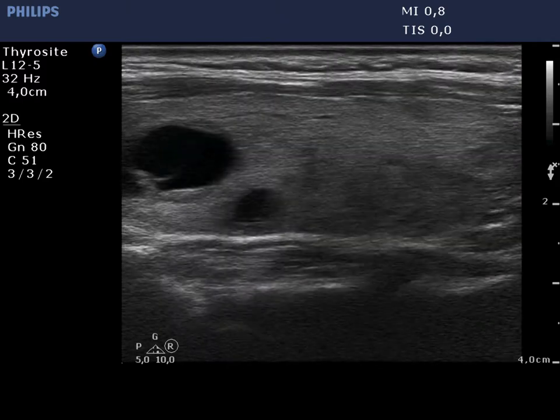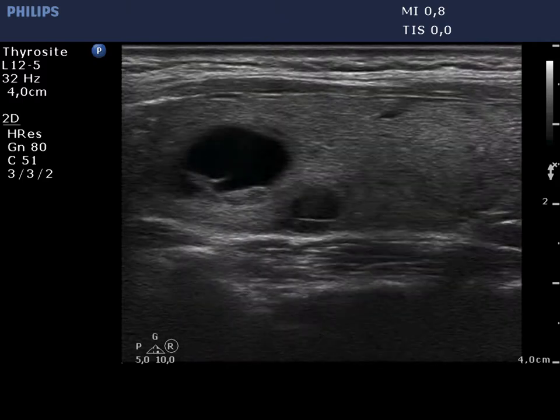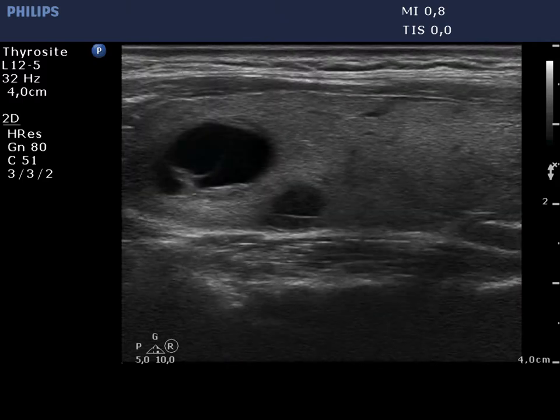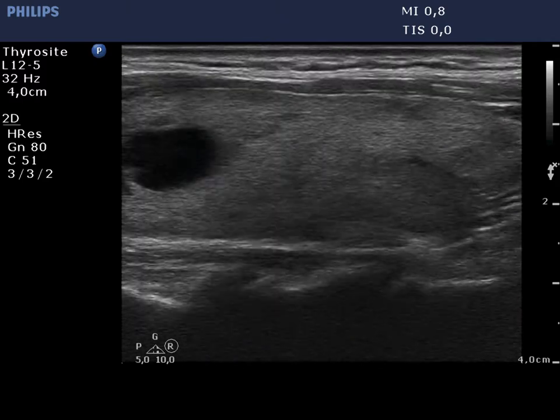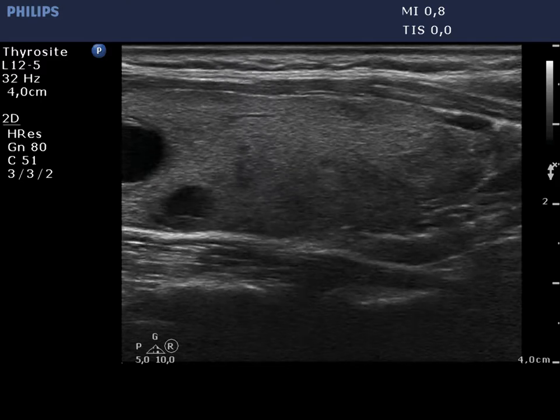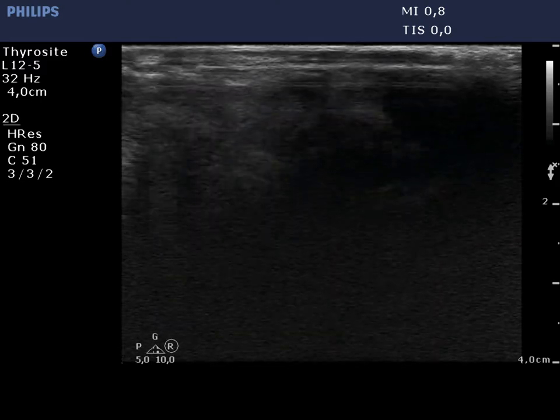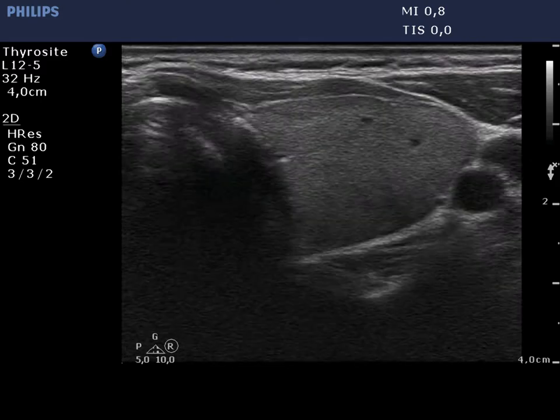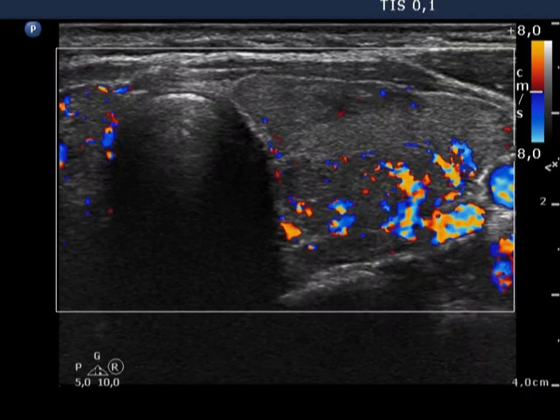The cystic area is left in the longitudinal scan, while the moderately hypoechoic part is right in the video. The latter displays an irregularly increased vascular pattern.